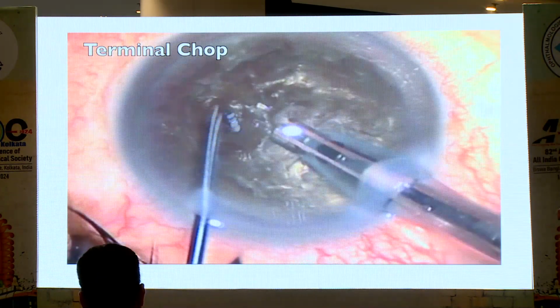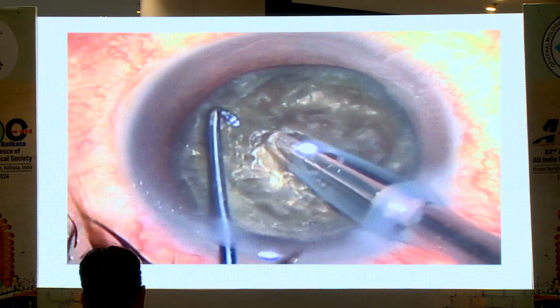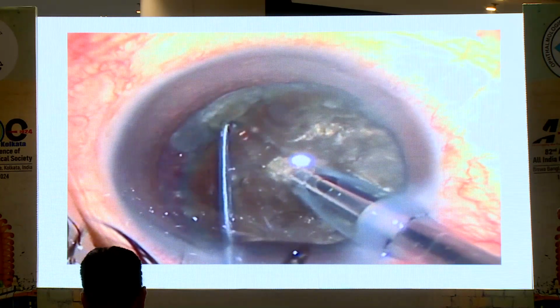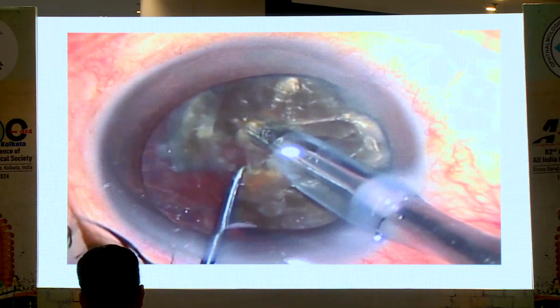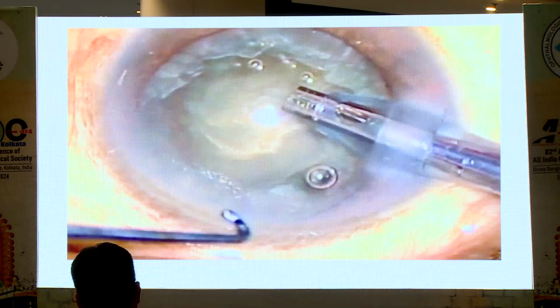So at high power and vacuum setting, superficial impalement towards the equator of the phaco probe. Then this terminator chopper goes behind the equator. So all the actions are parallel to the iris plane, pupillary plane. So it is divided full thickness.